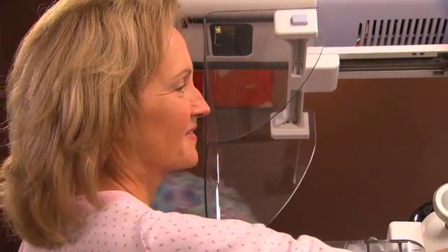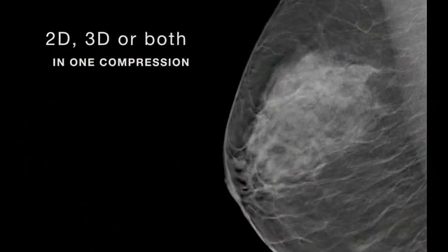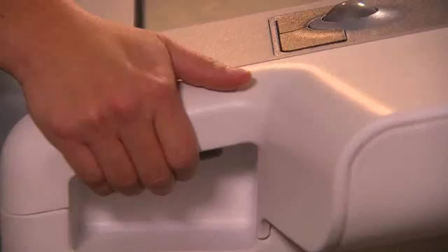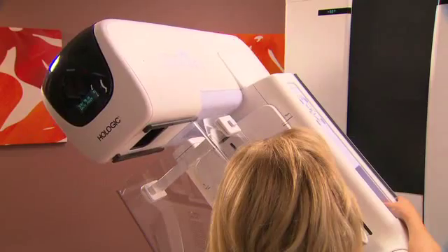The system is designed to perform mammography exams using either 2D or 3D, or both in one compression. To perform tomosynthesis, the imaging arm moves in an arc above the breast, quickly taking a series of very low-dose images.